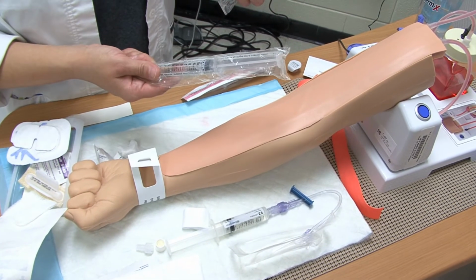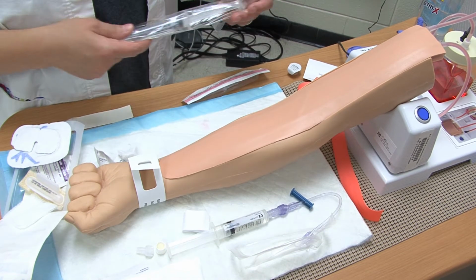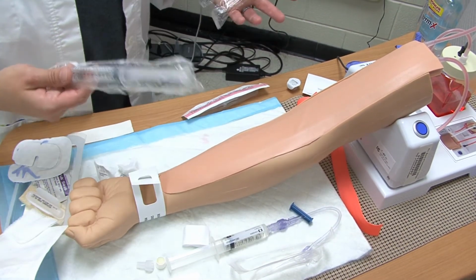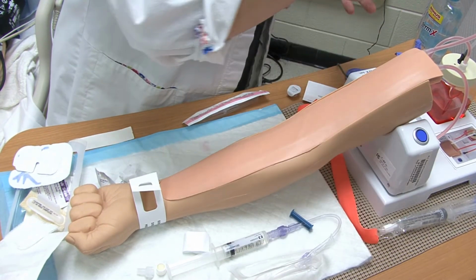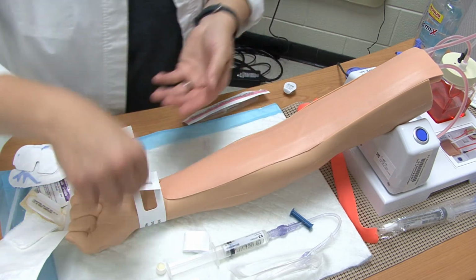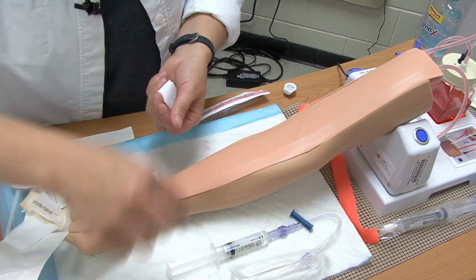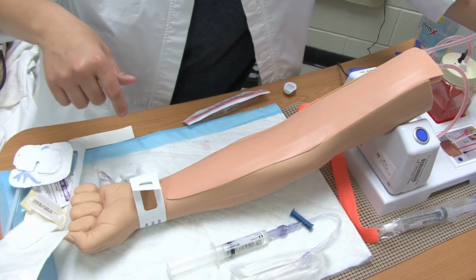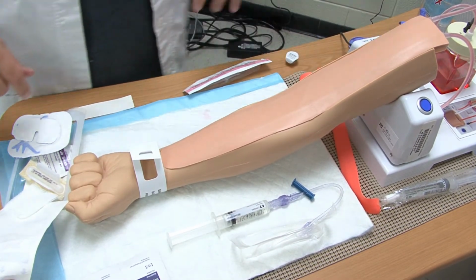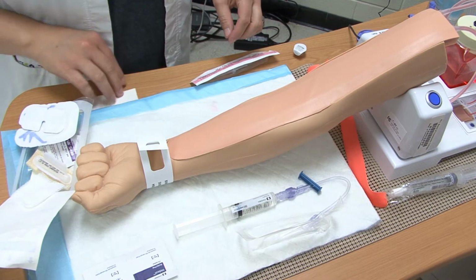Again, you might want to bring an extra saline flush with you, because once you've used this flush and take it loose, you can't reuse it again. So I'm going to put this over here for extra if I need it. I'm going to clean up and move any of my trash out of the way, such as any of the extra pieces. And as I'm doing it, I need to make sure that I do not disturb this or contaminate it. So I've got all my equipment set up here.